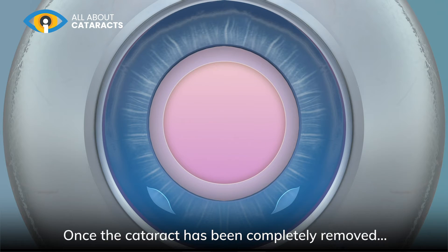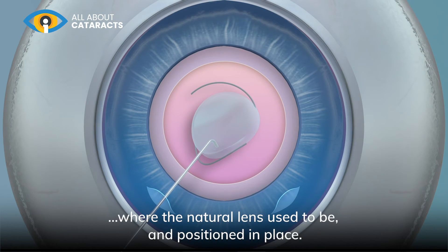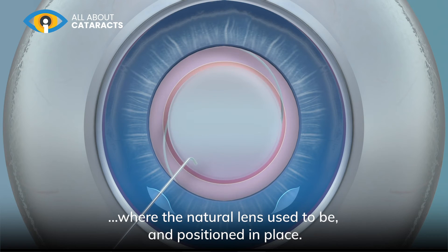Once the cataract has been completely removed, the artificial replacement lens is then implanted into the capsular bag, where the natural lens used to be, and positioned in place.